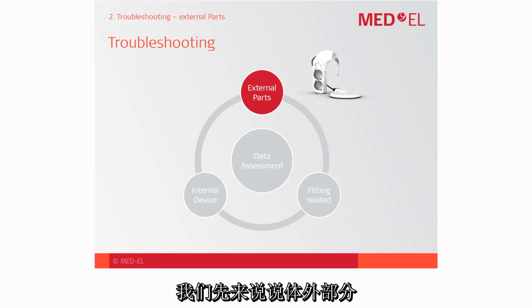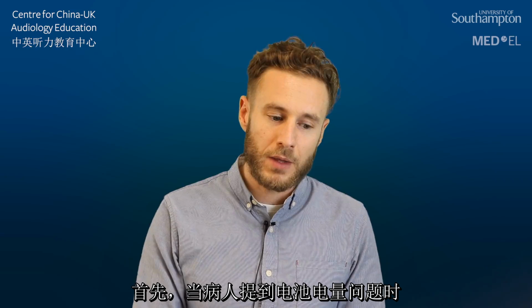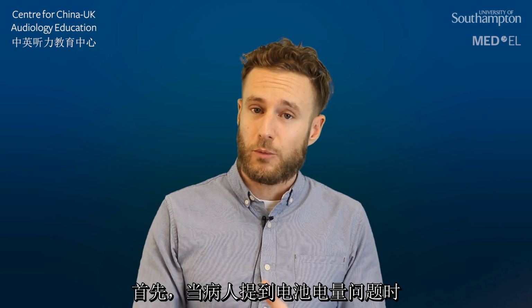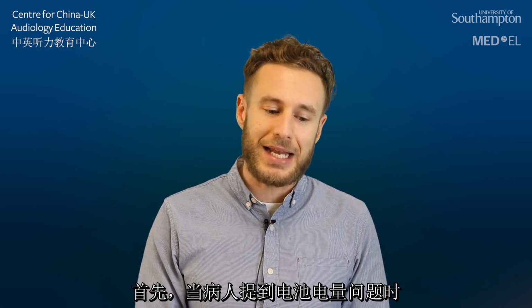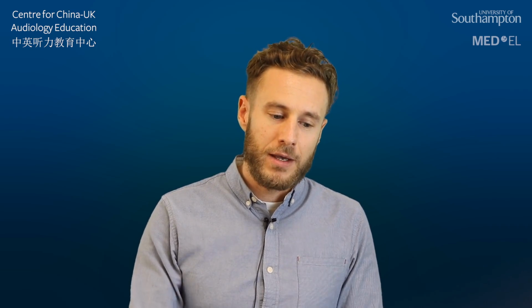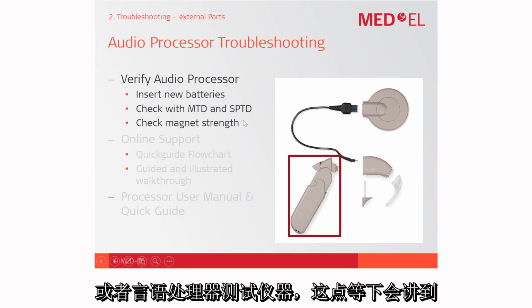So let's start first with the external parts. The external parts consist of the audio processor, which is typically the Opus 2 or Rondo. First of all, we would like to make sure, when for example the patient reports reduced battery life, that in the test setup, fresh new batteries are inserted into the battery frame. So we could use the microphone test device, the MTD, and the speech processor test device, which is shown in more detail on the next slide.